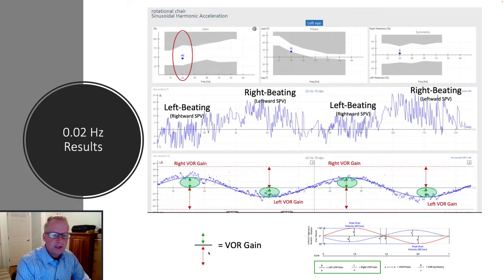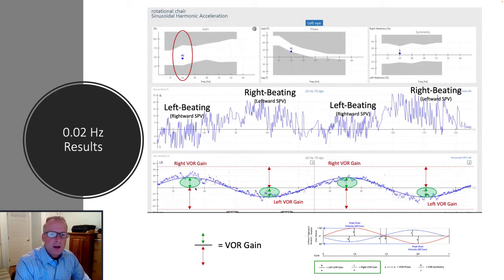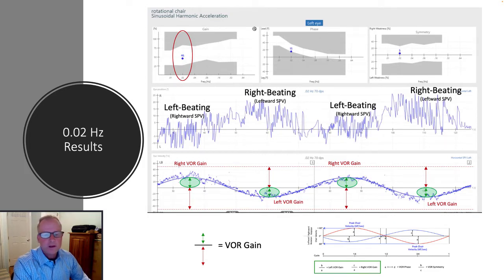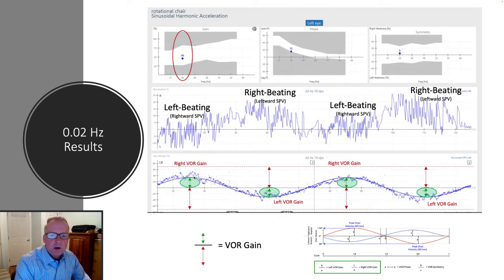That produces a VOR gain response. As you can see here, the eye response in relation to the overall chair response, or chair stimulus, produces a VOR gain that's approximately 50%, or about 46. The VOR is never going to be perfect.